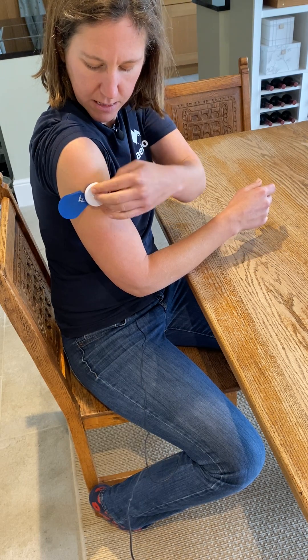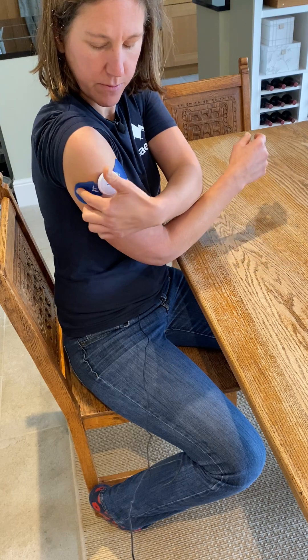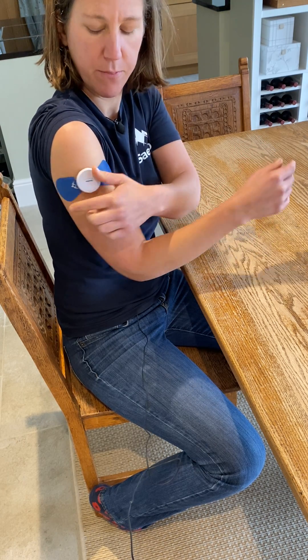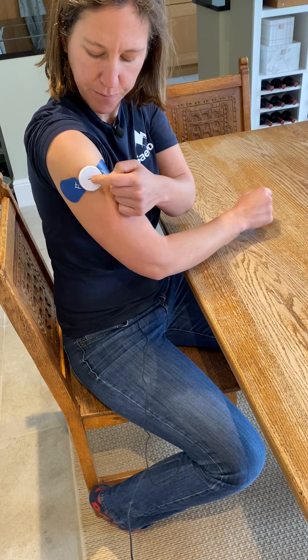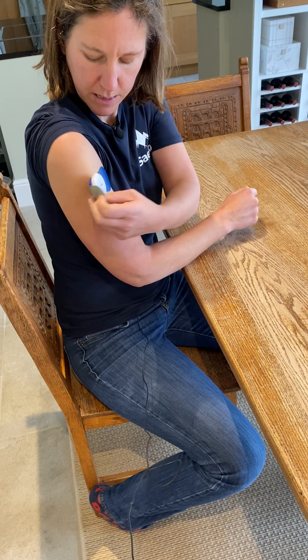Place the white disc down the side of the arm so that one of the electrodes wraps around towards the back of my upper arm and the other electrode around towards the inside of my upper arm. So that's set up one. Carefully peel off.